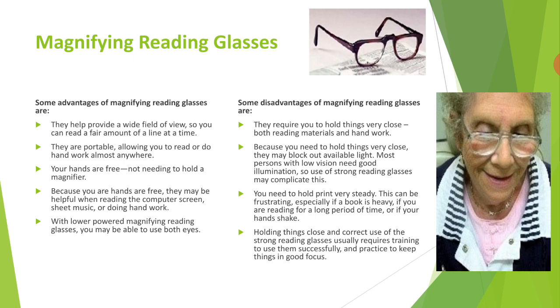When the patient needs to hold the print very steady, it can be frustrating, especially if the book is heavy. If the patients are reading for a long period of time, their hands may shake. When they hold the book too long, their hands tremble. Another one, holding things close, as required for strong reading glasses, usually requires training to use them successfully and practice to keep things in good focus. Okay.